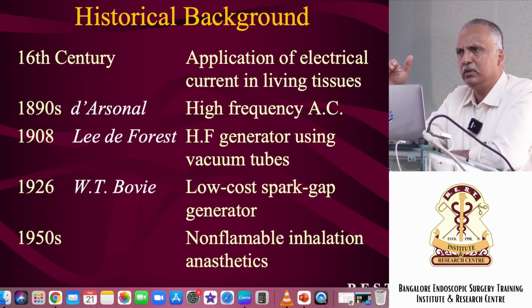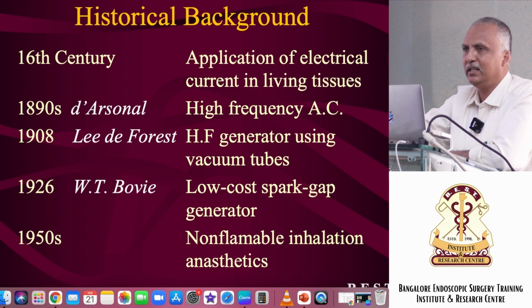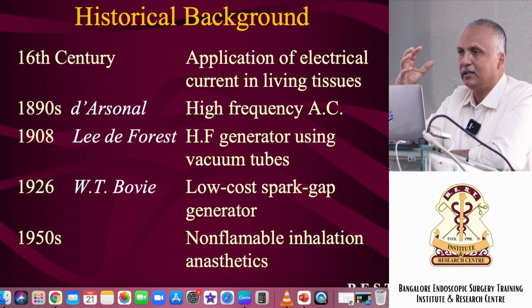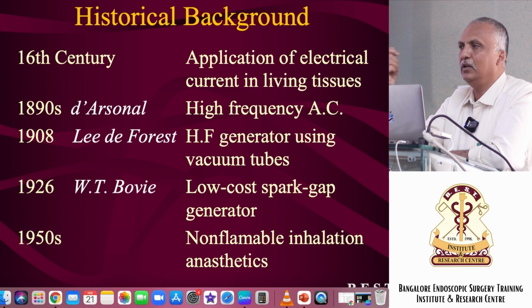And anybody who has come from the US, you talk to them, they say, give me Bovie. They don't say, give me diathermy, give me cautery. They'll say, give me Bovie, because Bovie is the machine that was there for ages together. For many decades, that was the only machine. So they've been calling it Bovie.